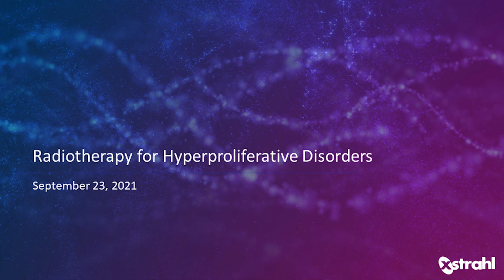Okay, thank you. And final question: what do you do if patients have increased nodule size that's outside your electron beam field after the 3-month planned break? So this has happened only once or twice. When the patient came back, in initiating the second phase of the split course treatment, I always put the light field on with the vac lock, and 1 or 2 patients have had the nodule that had grown, if you will, outside of the light field.